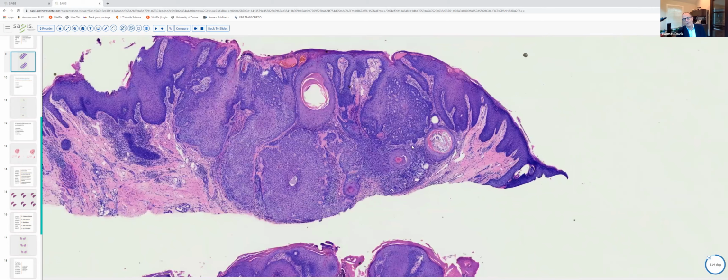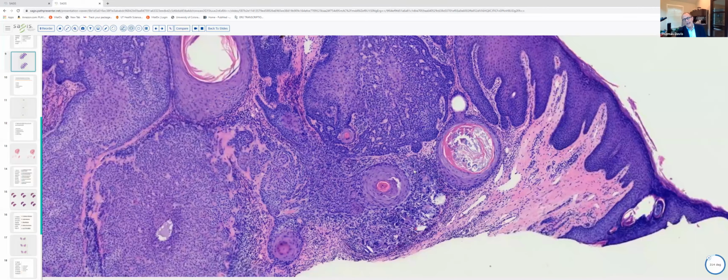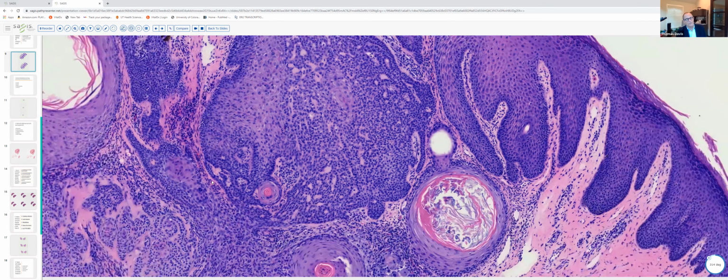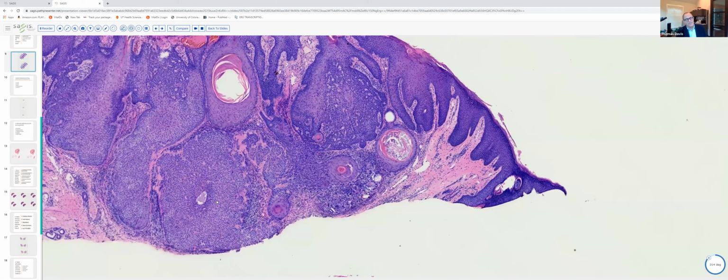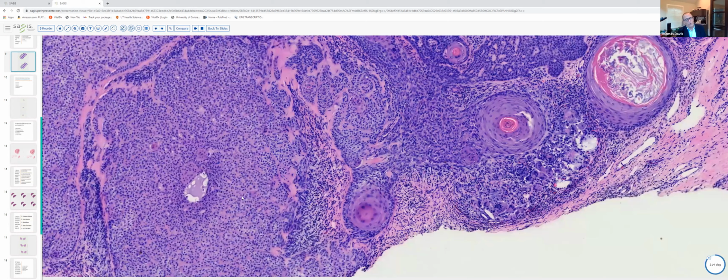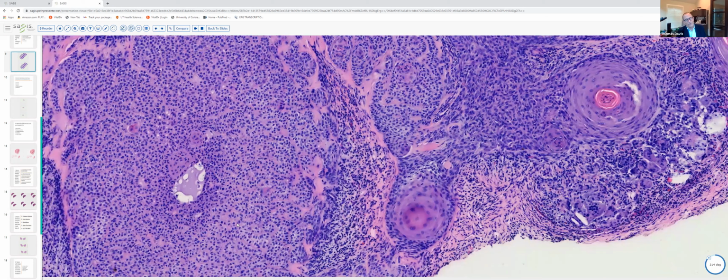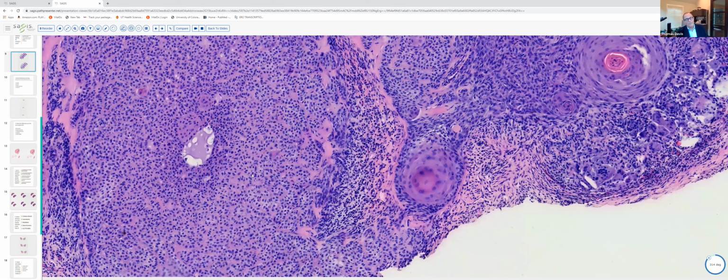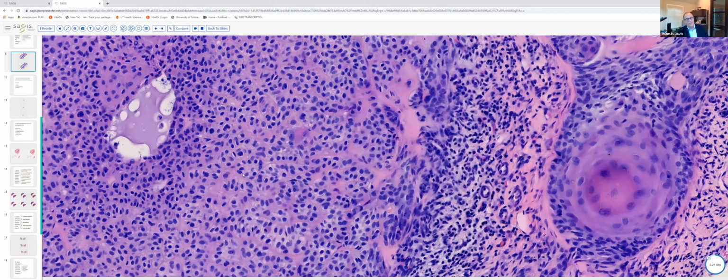At the periphery of the neoplasm, these aggregates are composed of somewhat basaloid appearing cells. But if we look at the central portion, we can see that these cells look a little more like keratinocytes from follicular epithelium. They're larger, like those in the mid-spinous layer. And most of these have vacuolated or clear staining glycogenated cytoplasm, giving it this clear staining color.